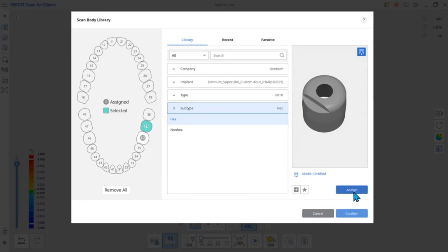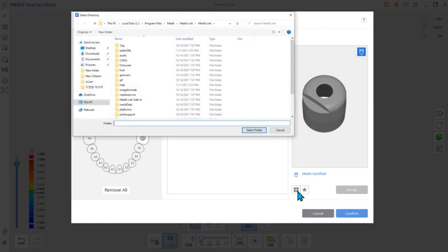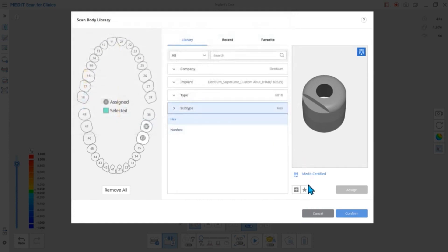MeditLink provides libraries, but you can also use the plus button at the top to add more. You can only register files that are STL, OBJ, and PLY file types.